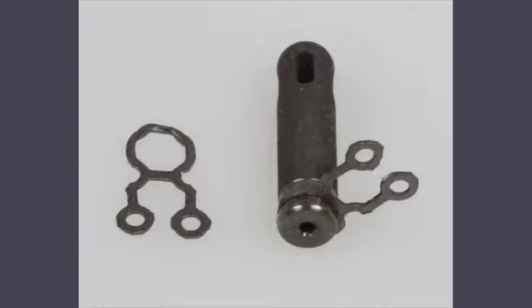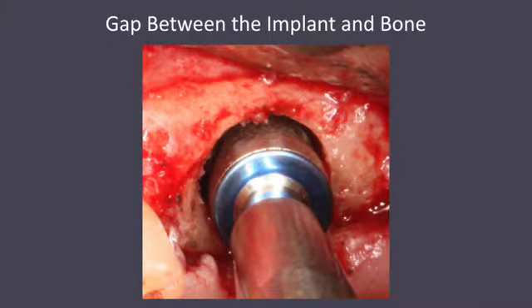It is not of the modern design of implants that have special coatings and SLA surfaces. This is a basic primitive implant, which is basically an additive surface with titanium plasma spray. As you can see, there is no contact between the living bone and the titanium cylinder.